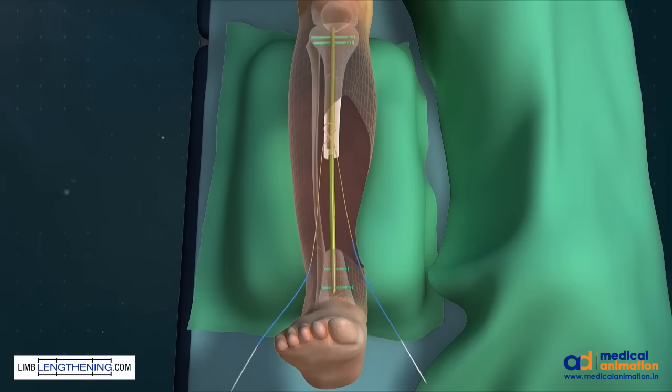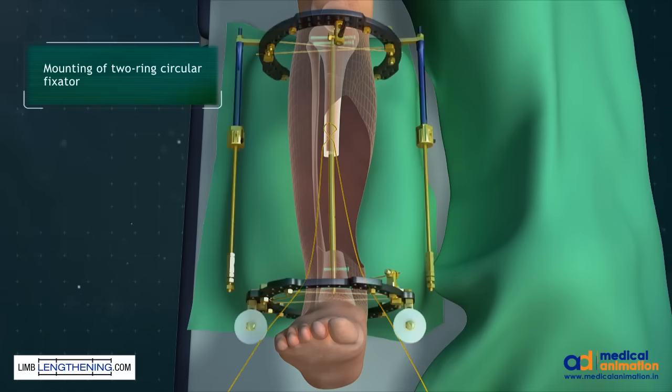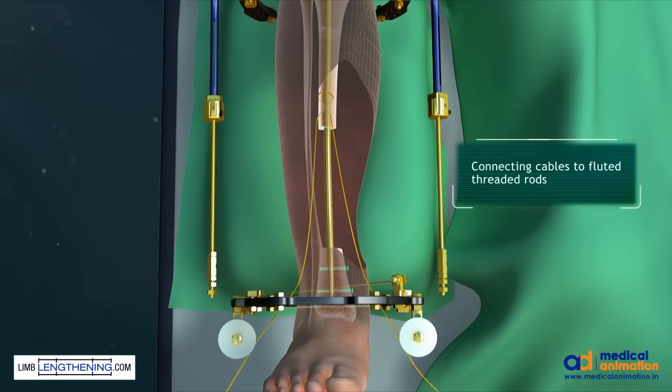The wounds are then closed in a standard fashion. A 2-ring circular fixator is then applied. Care is taken to avoid the path of the nail or its components. Two pulleys are assembled to the distal ring as seen.